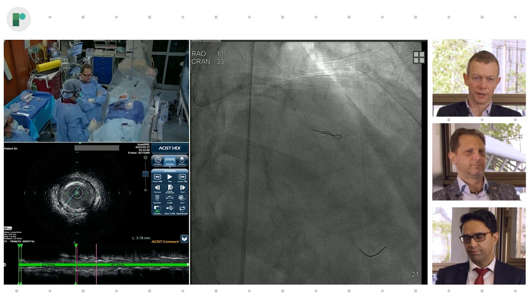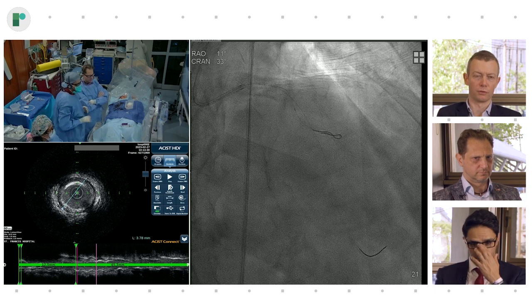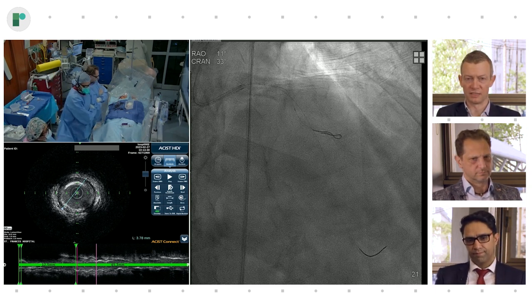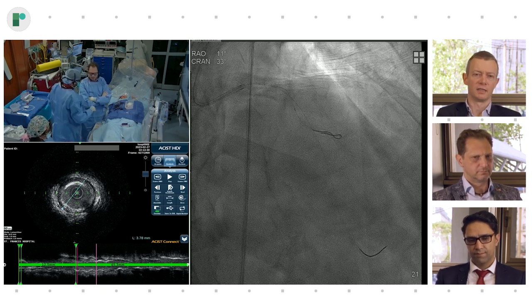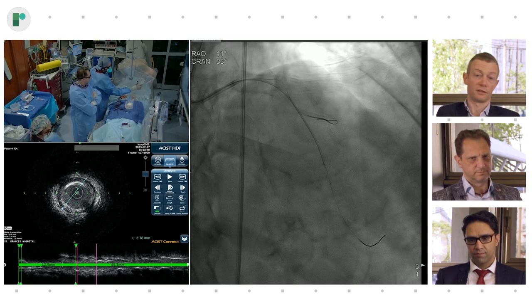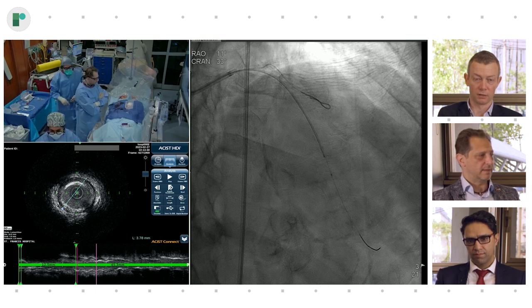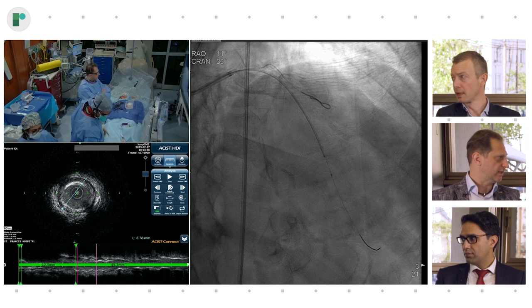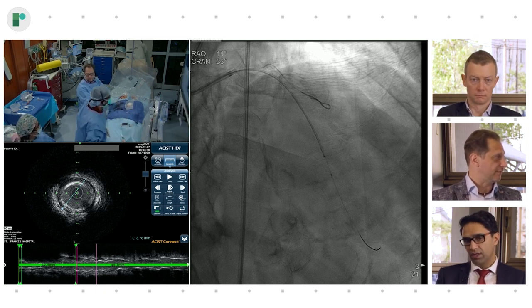Yeah, so what you're doing here is trying to get a better appreciation of the true vessel size in order to determine the size of the post-dilation balloon, right? So you pick the stent size based on the distal reference lumen in this case, and then upsize. So make sure you have a stent that you can upsize to the desired size, and then pick your post-balloon. And upsize aggressively, right? Yeah. I think we might pick a 2.25 stent, but we go in with a 3.0 distally, and then a 3.5 proximally.